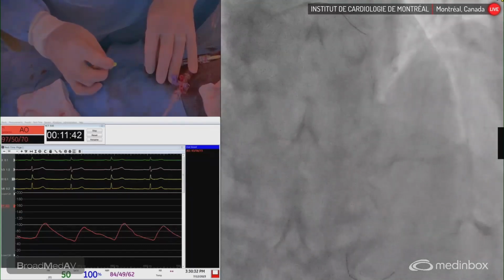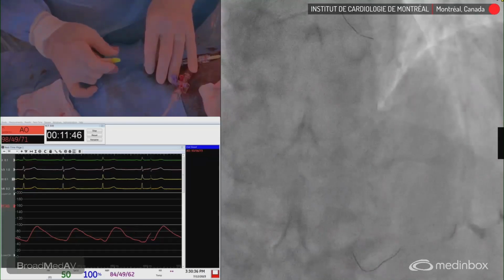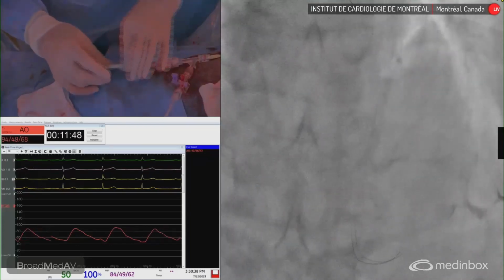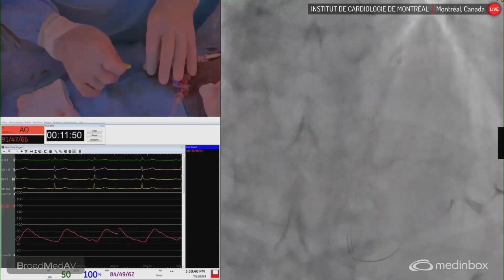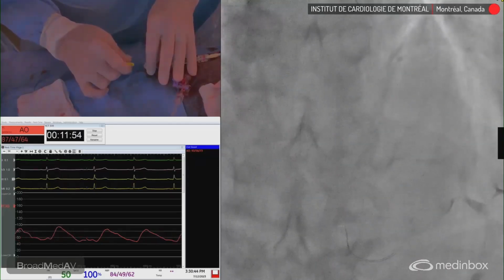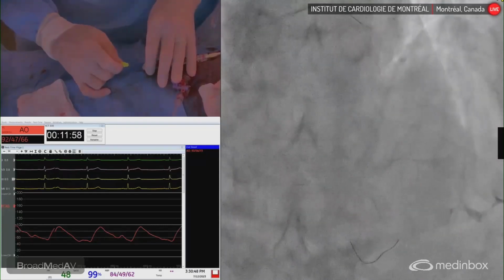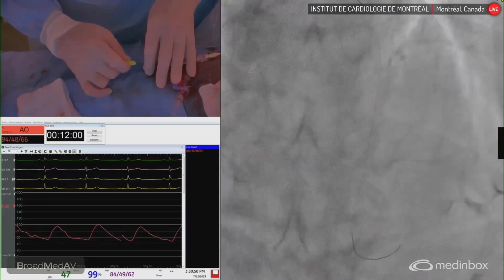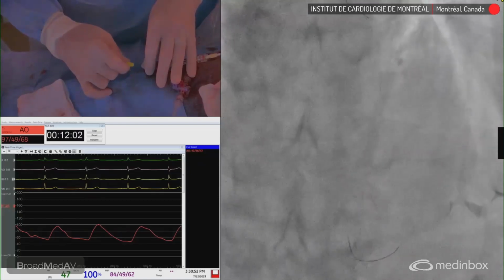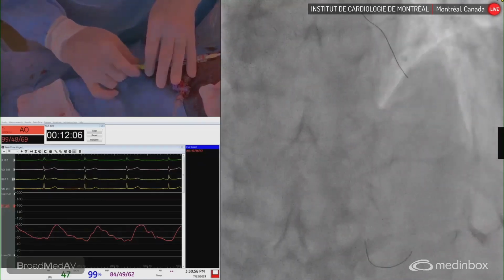So of course, somehow this was easy to wire initially. Now it's not so easy, so it can happen. We're going to take enough time to do it. Je pourrais avoir un guide run through, s'il vous plaît. Ouais, c'est passé.